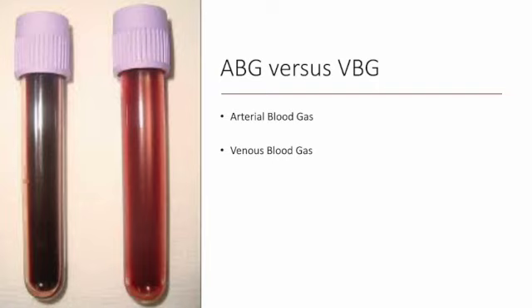However, if a patient does not have an arterial line in place, then you have to get an arterial blood draw. And getting arterial access is very painful for the patient. And additionally, there's a risk for hematoma formation, for bleeding, and sometimes nerve damage can be associated with getting arterial access as well. So the advantage is an ABG is very accurate, gives you very accurate information. The disadvantage is that there is risk associated with getting an arterial blood draw.